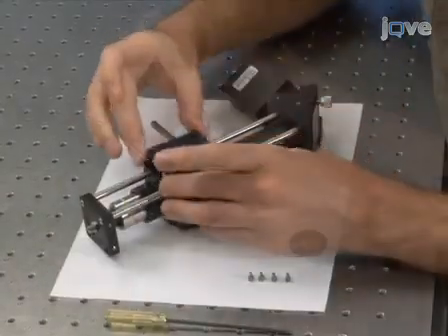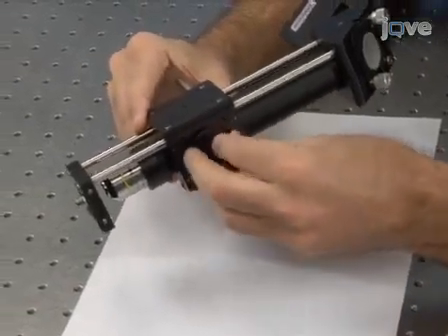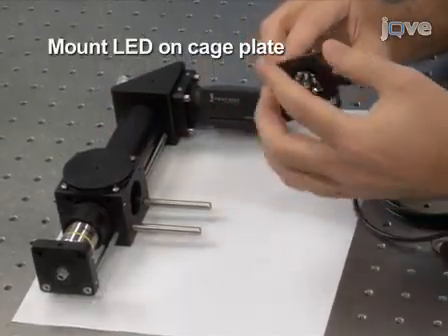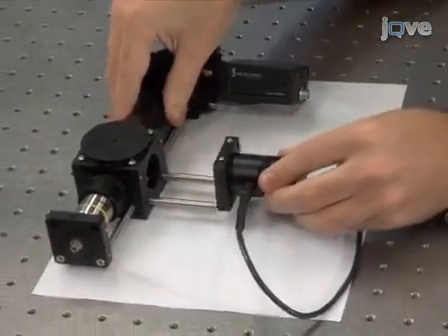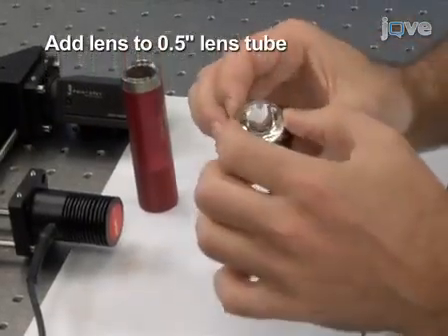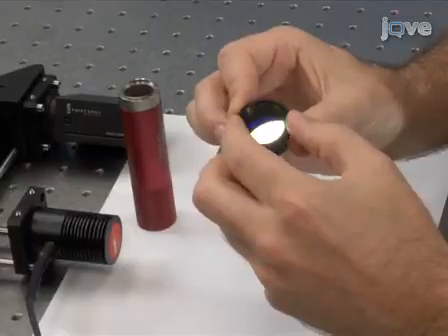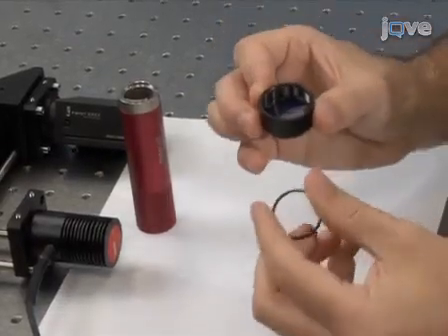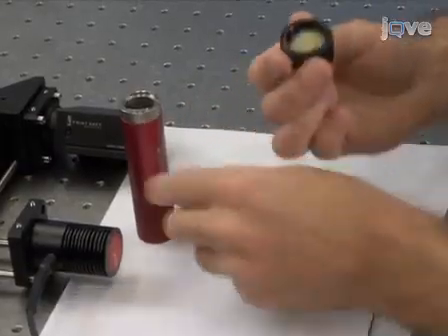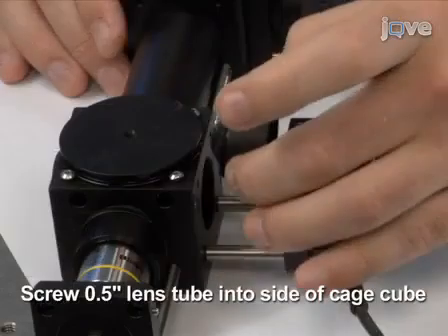Add the base plate and end cap to the open sides of the cage cube. Then, mount an LED on a cage plate and slide it onto the end of the 2-inch rods. Add a lens to a 0.5-inch lens tube such that when this tube is screwed into the side of the cage cube, it will form an image of the LED that fills the back aperture of the objective lens. Also, add the excitation filter to the lens tube at this stage. An LED driver can be used to control the illuminating light intensity.